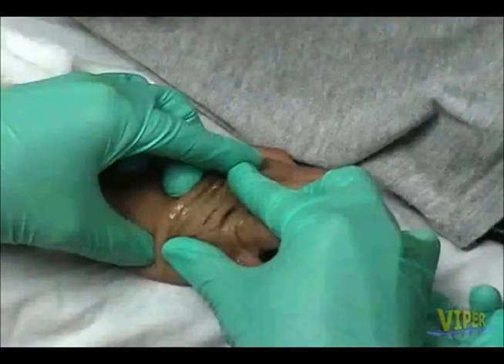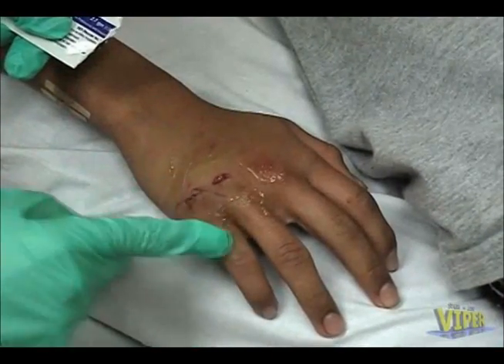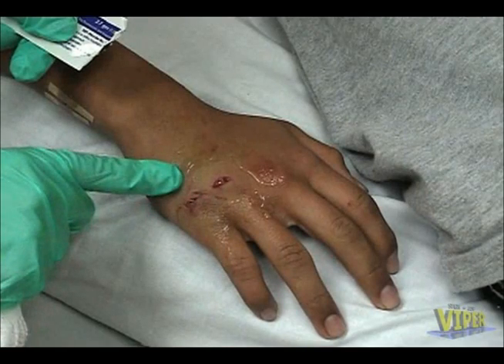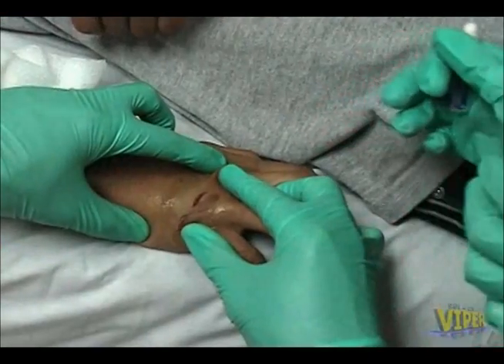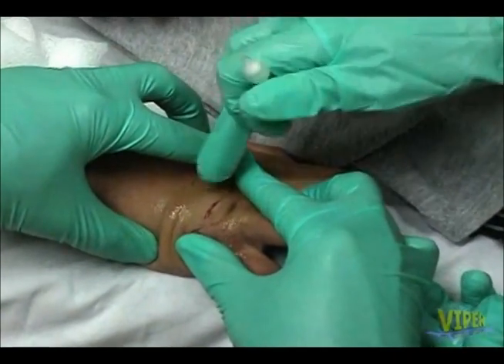To correctly apply the tissue adhesive, first be sure that the wound edges are well approximated and dry. To prevent the liquid tissue adhesive from trickling into undesired areas such as the eyes, a circumferential application of a petroleum-based product such as Neosporin will form a protective barrier.